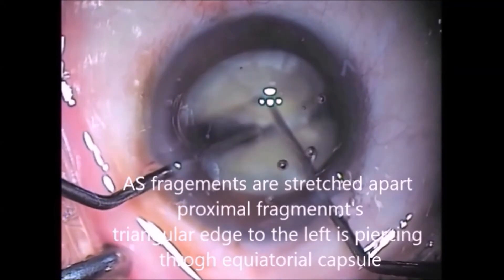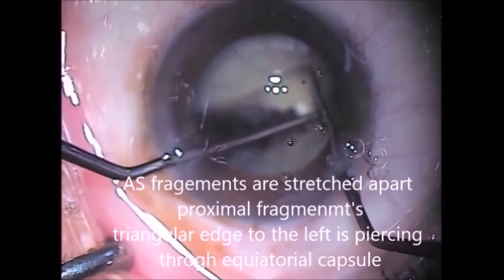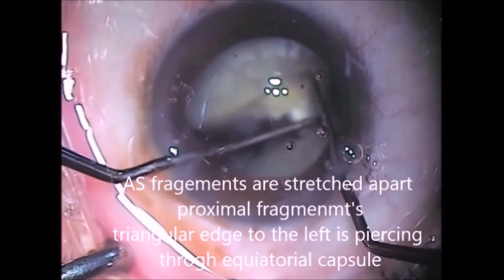What exactly happened? Let us see the replay. As I was separating the two fragments, because of excessive lateral pressure, the proximal fragment pierced the capsule at the equator.